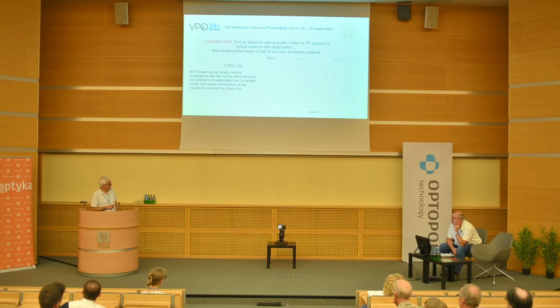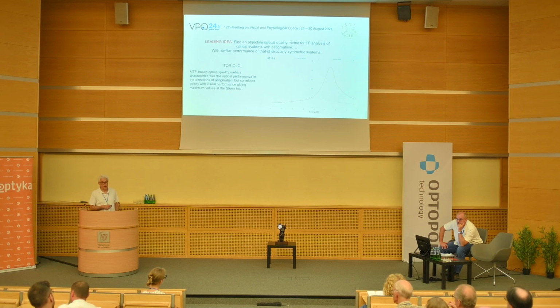And if we read these images in the same way as the graph before, we would say that we see better in the two foci of the lens, in spite of the circle of least confusion, which is where we are supposed to see better.